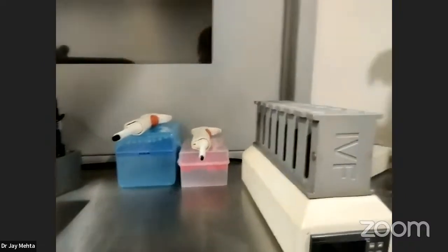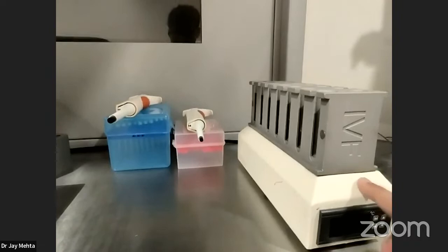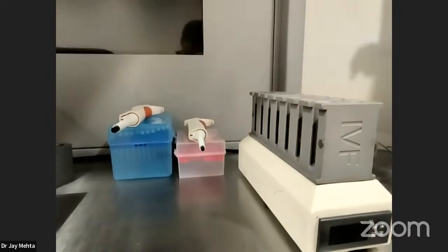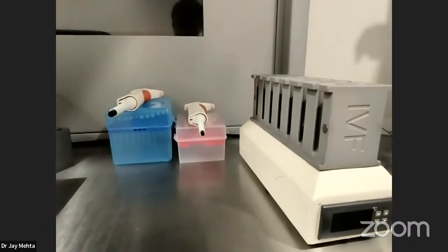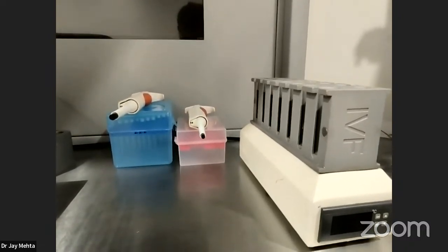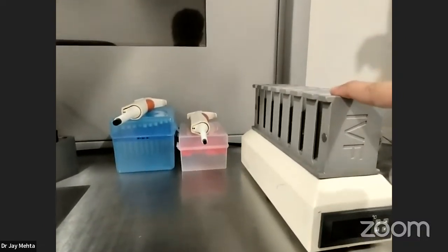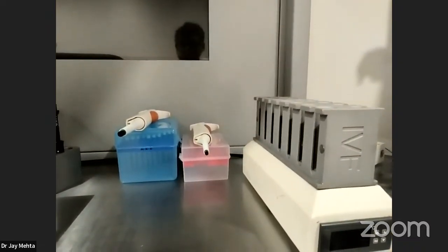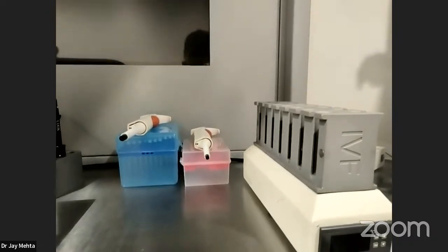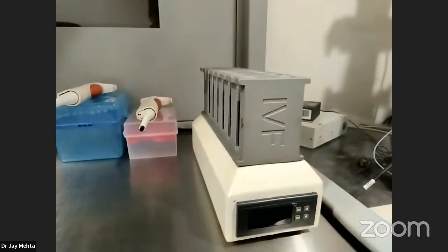Okay, see this. This is a very important part of your laboratory, the heating block. A lot of times people use an incorrect heating block. They don't have a temperature guided heating block. What they depend on is the ambient air temperature to ensure that the heating is correct. If the heating is too much or too little, in both situations it can affect the spindle formation of the oocytes. So keep that in mind. Very important point. People often don't realize this and often make a mistake in this.